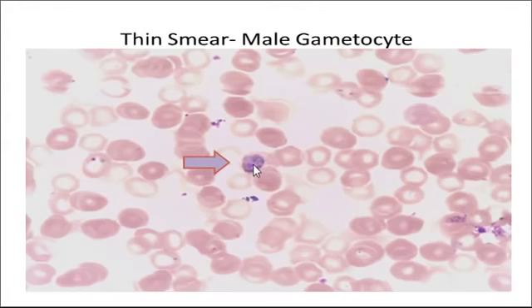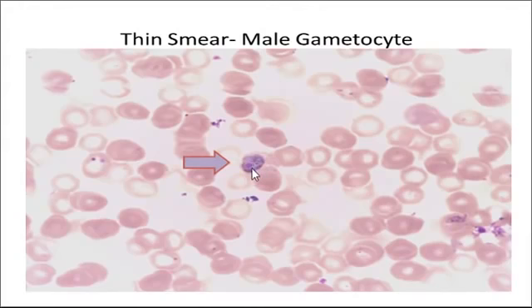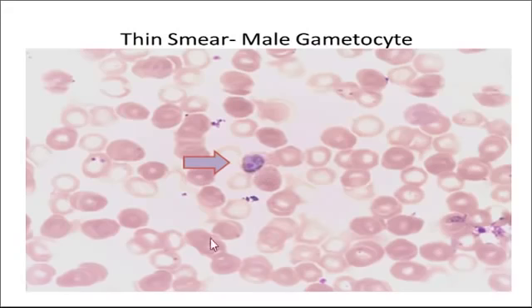This is the male gametocyte. In this, you can see the chromatin dot is more centrally located — it is a large pink to purple chromatin dot — and it is surrounded by a pale halo. The pale halo is evident here, and you can also see the cytoplasm around it.